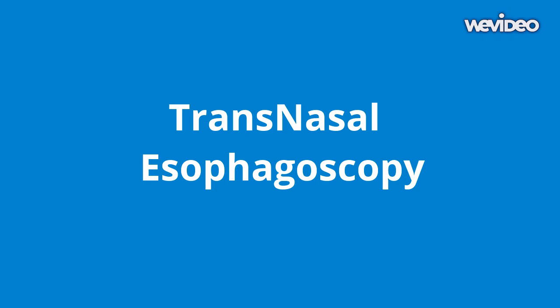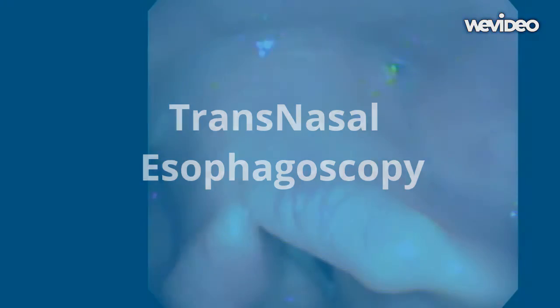Transnasal esophagoscopy. The transnasal esophagoscope is passed into the throat and the vocal cords are visualized briefly. The scope is passed just behind the vocal cords down into the esophagus and swallowed. Once swallowed all the way, visualization is achieved of the stomach.